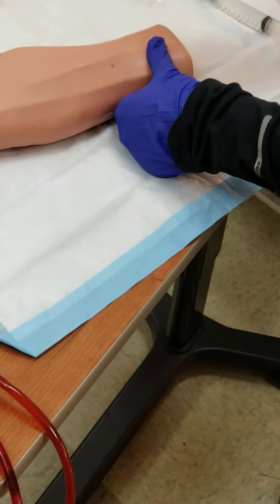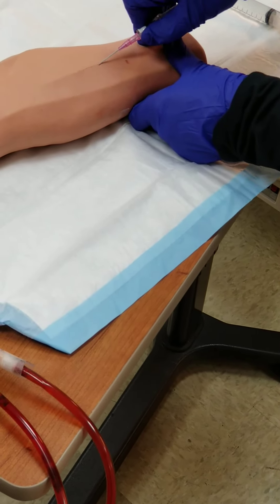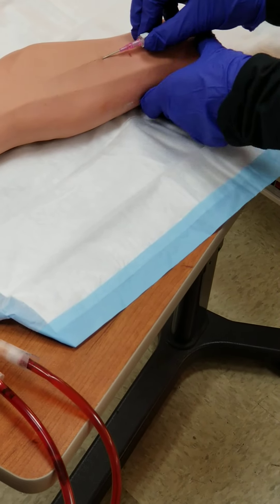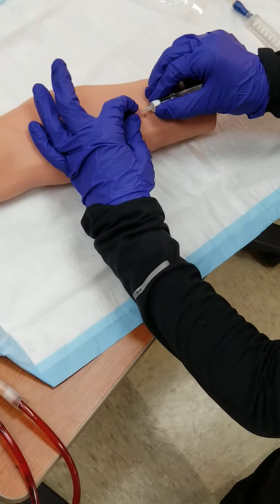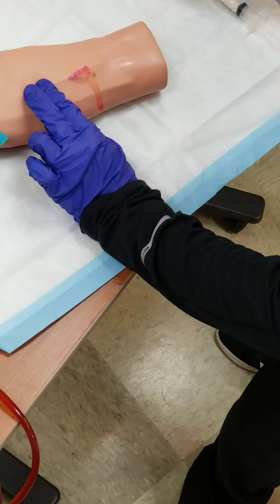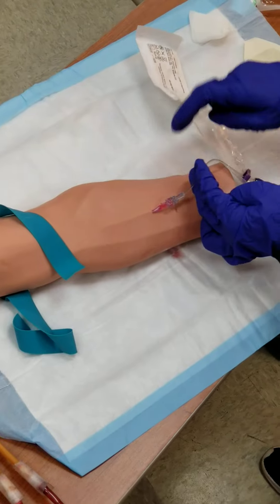Let's try it again. And if I did that, I'd have to clean it again. Did you see it? Yes, it was very, very light. It's flowing. So I want to lower this here, I want to thread this here. Only the catheter goes in the skin — not the needle. Once it's flush with the patient, take this off. Safety that up — and it's going to start flowing. Your patient will not bleed out from a little poke there.